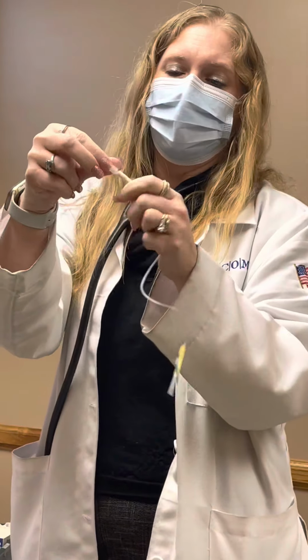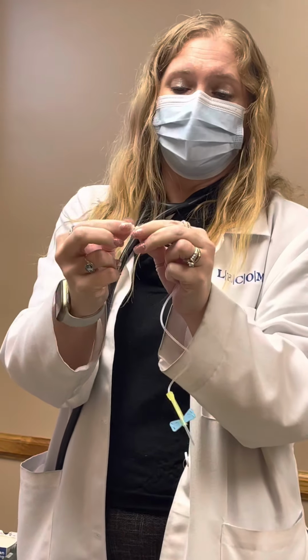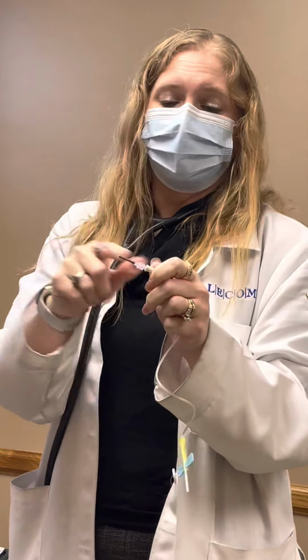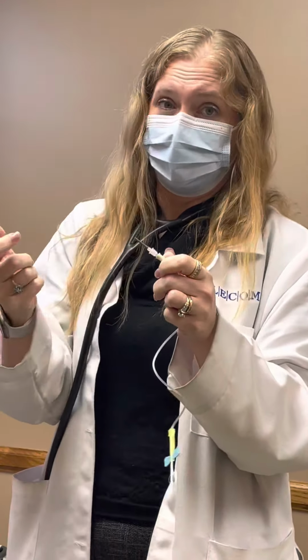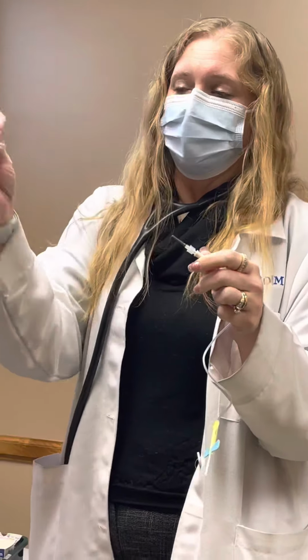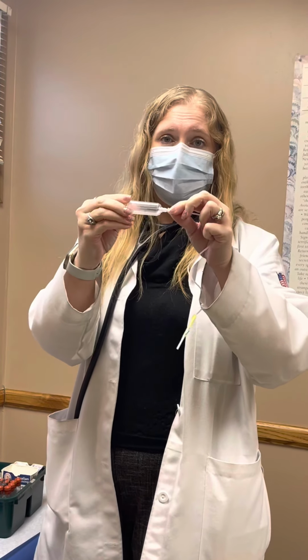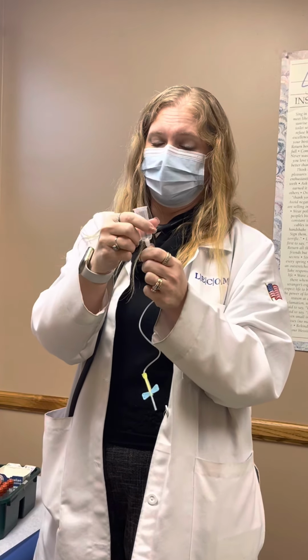Right here, you want to make sure that this is connected well. Push it in, because otherwise if this is loose, blood will flow out here and not into your test tube. So this is the vacutainer. It only goes on one way. It screws on, so screw it on and make sure that it's firmly connected. In this gray part is a needle, and that's what pokes your test tube. So make sure that you don't poke yourself accidentally with that.